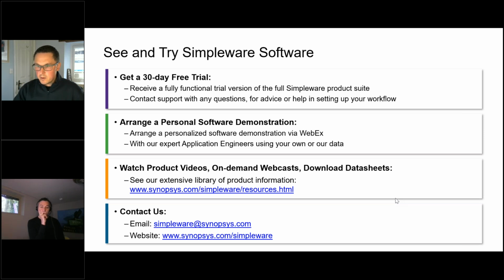Anything from your side? For any of the custom solutions, the way to think about it is, if you have a workflow in Simpleware or any software where you can consistently segment and generate models that have value to you, and you want to scale that up, we can scale that with Custom Modeler.